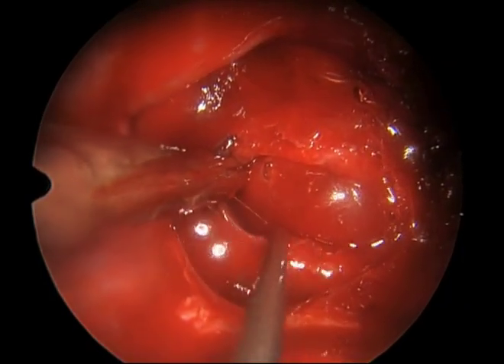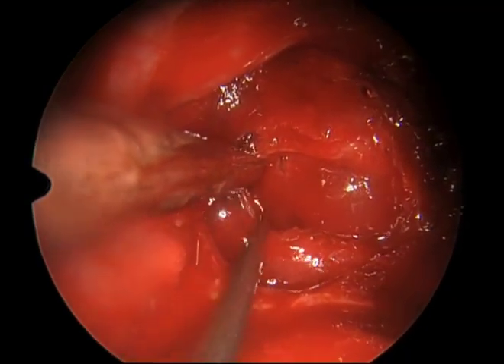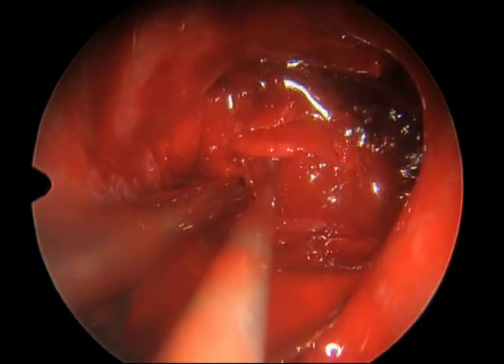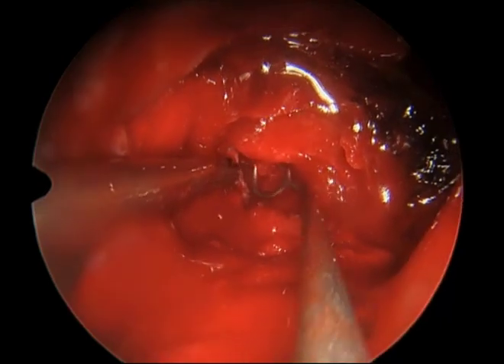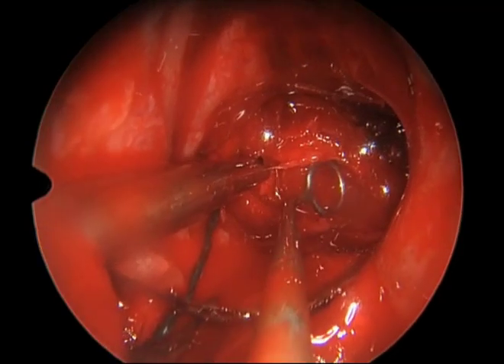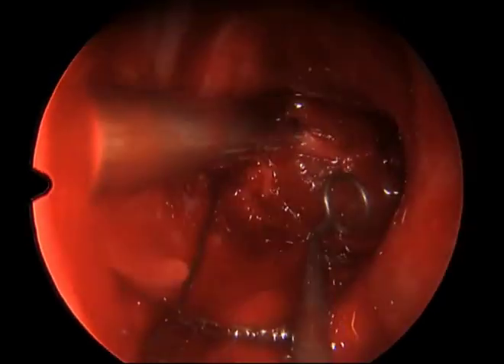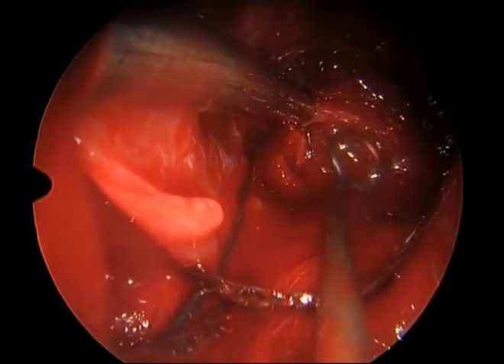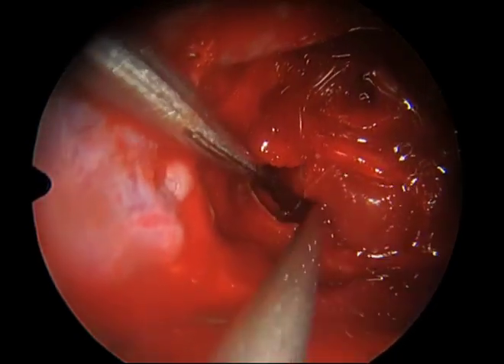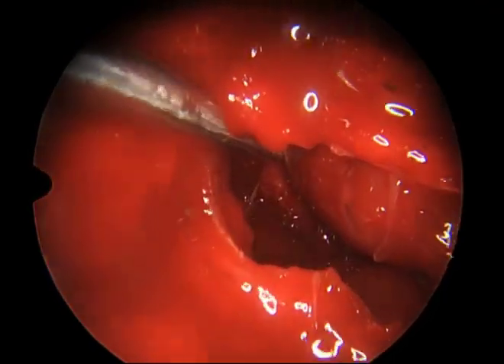Here we are at surgery. We can feel for the presence of tumor along the lateral walls of the sella, which is the cavernous sinus, both inferiorly and superiorly, checking and feeling for any residual tumor. We then can take the endoscope and actually go all the way into the sella and directly view the intrasellar contents.